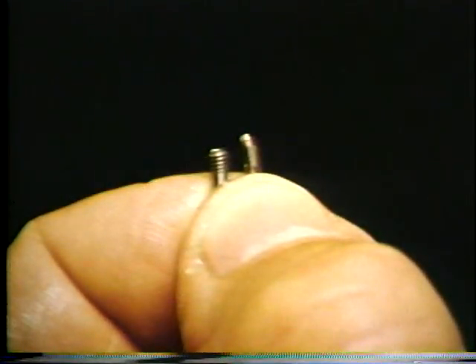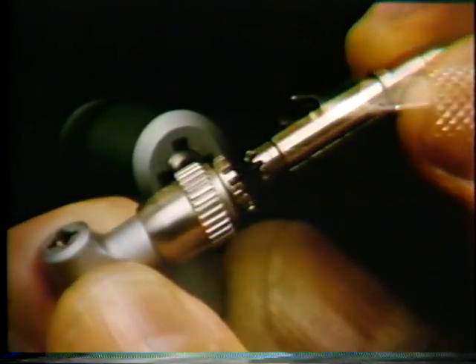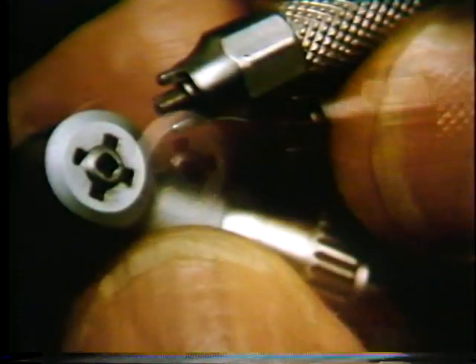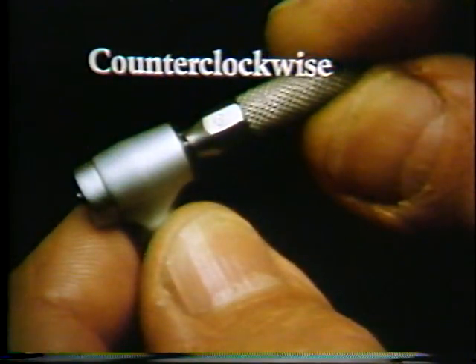The weekly maintenance of the friction grip is different, since you have to clean the chuck, which has two parts. Before removing the chuck, pull out the drive shaft. One side of the contra-angle head has a hole surrounded by 4 notches. Insert the 3-pronged burr tool into this hole and lock it down by twisting the handle. Turn the burr tool counterclockwise and carefully back the threaded part of the chuck out.